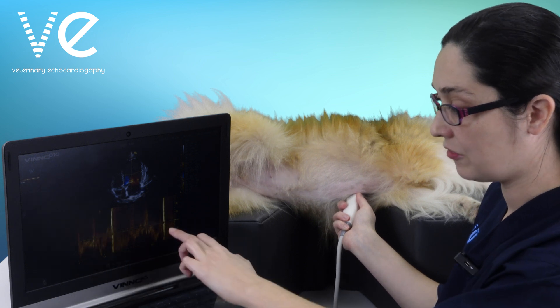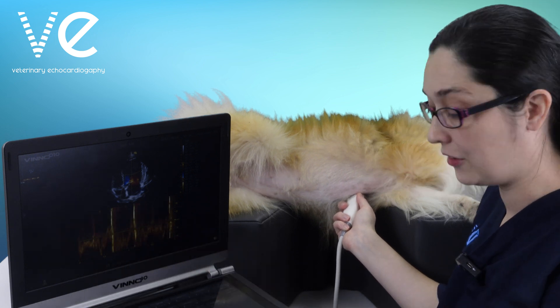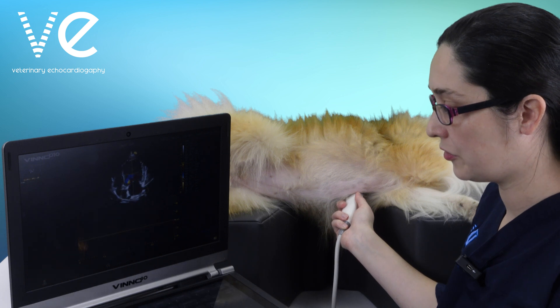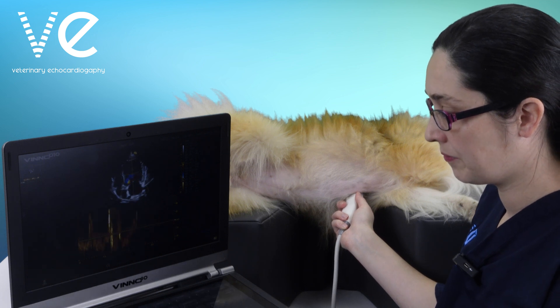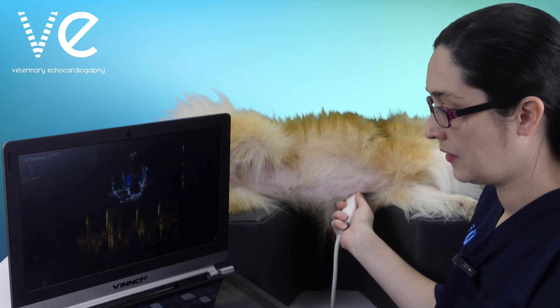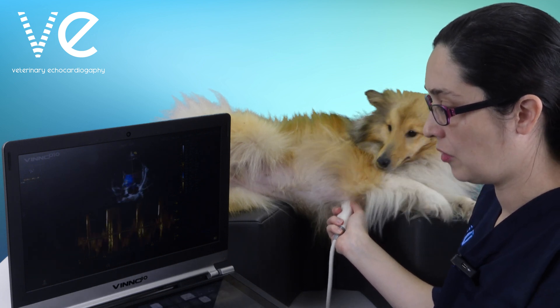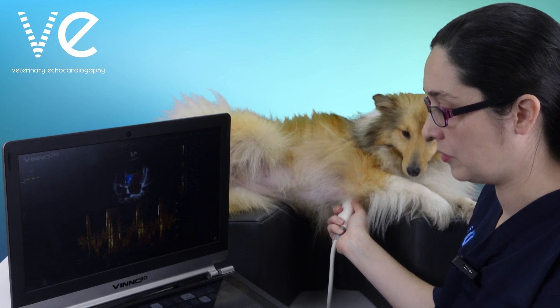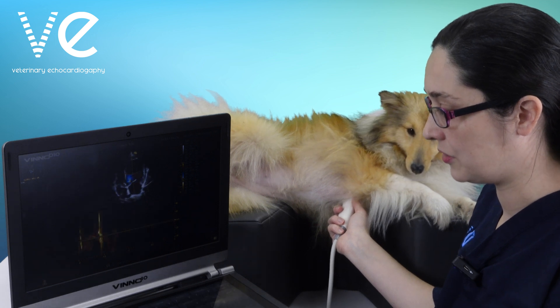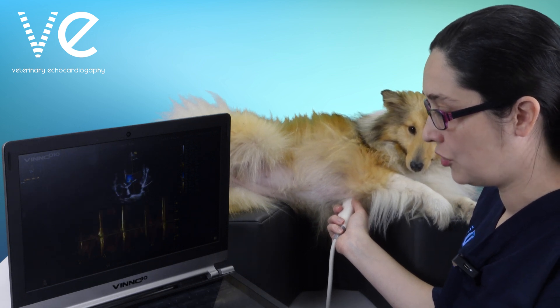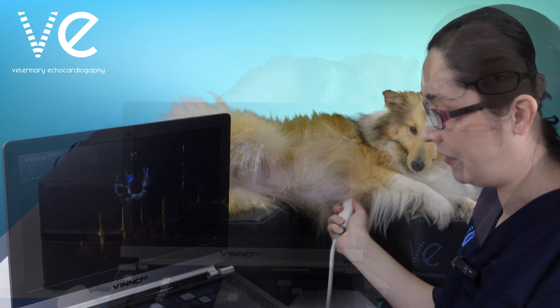I'm getting a nice outflow but not getting a good inflow, so I'm going to need to reposition that and try a different spot. And with Doppler here, it's particularly difficult because we have aortic regurgitation to try and dodge as well.